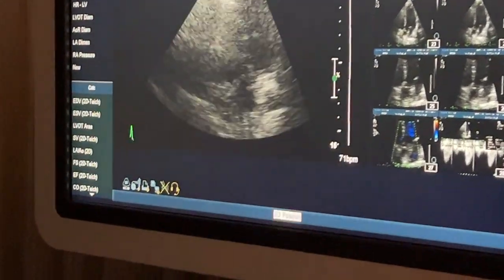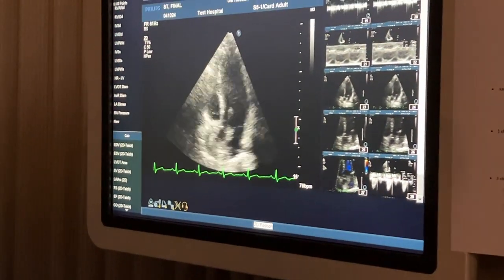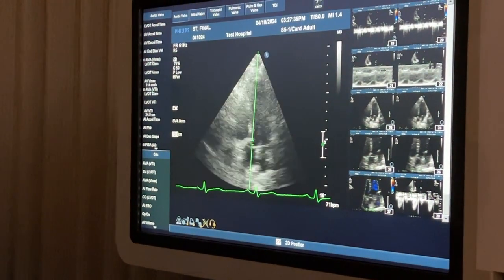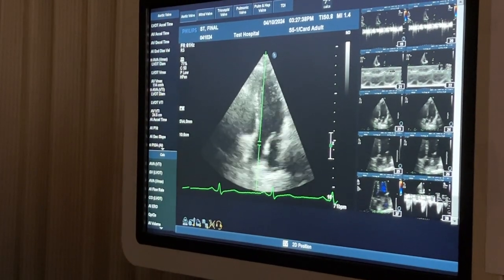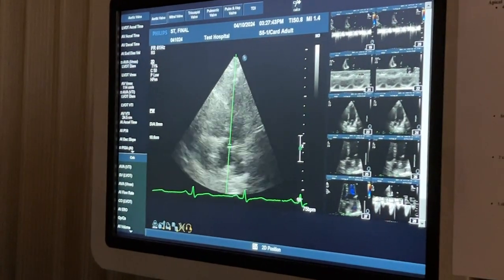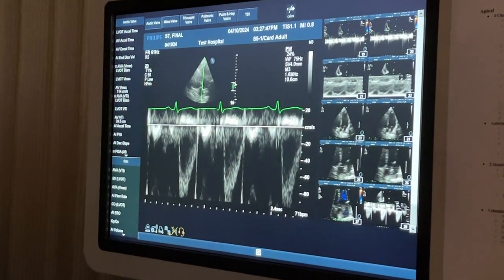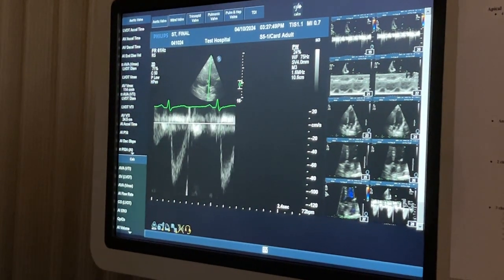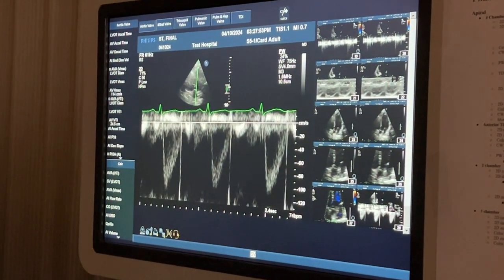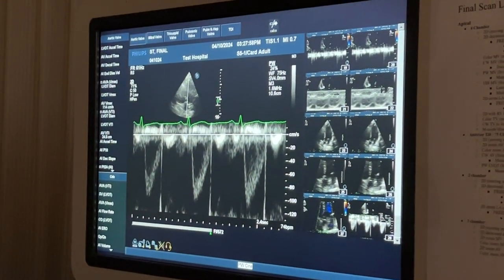So now I'm going to come out of this entirely and we're going to do a pulse wave at the LVOT. So it's going to be kind of the same area that we're sampling, but we're going to go right before the valve opens. So what side of the aortic valve? Is it on the aorta side or the LV side? LV side. Good job. Gotta lift my baseline up because we're looking below the baseline. Gonna increase my scale. Oh my God, so pretty. Beautiful. I like the middle one.